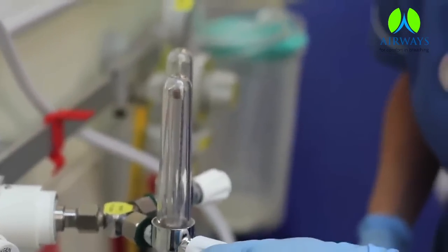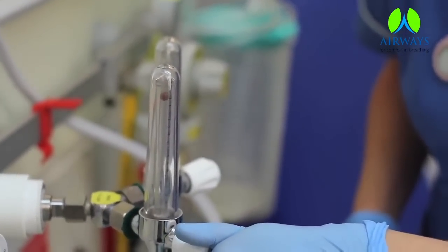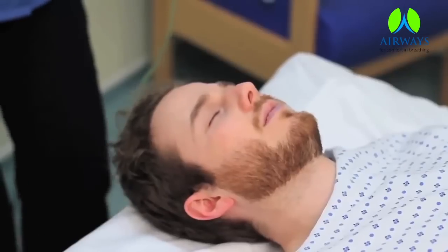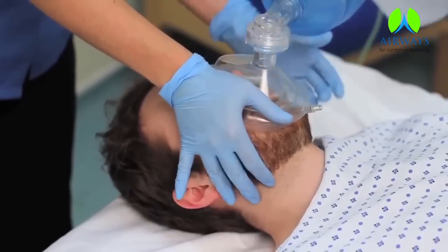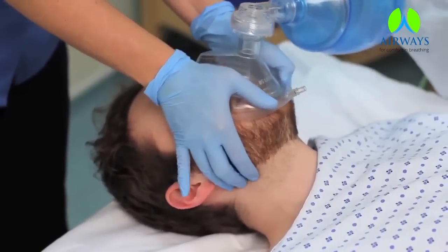Attach the tube with oxygen supply and turn on the oxygen. Place the mask on the patient's face. Be sure for the right sized mask. Hold the mask ensuring nose is suitably covered.